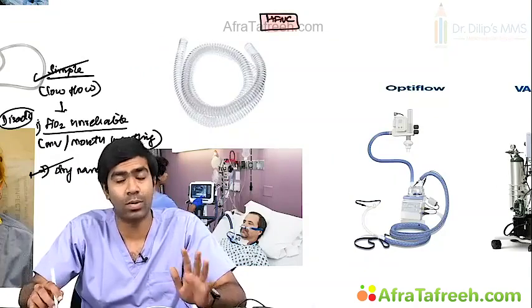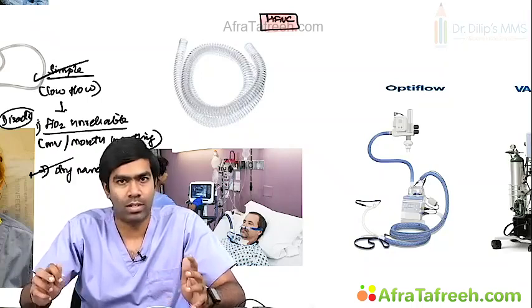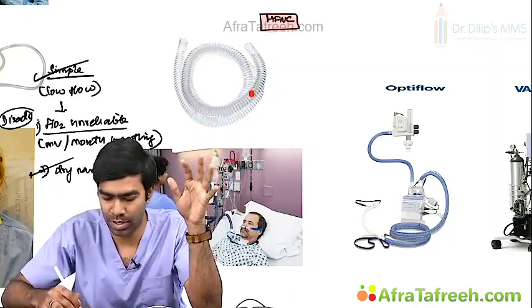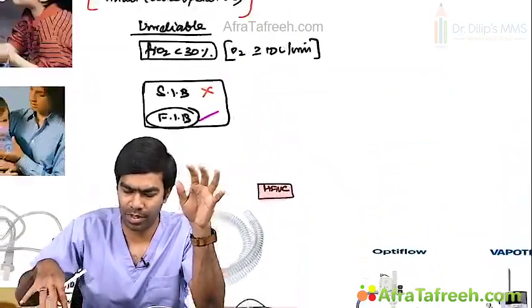It's a definite question in your institute exams. High flow nasal cannula. What this high flow nasal cannula does, it needs some special devices. For example, the tubing itself should be very special. It should have a corrugated tube. Not only for high flow nasal cannula, any high flow devices.